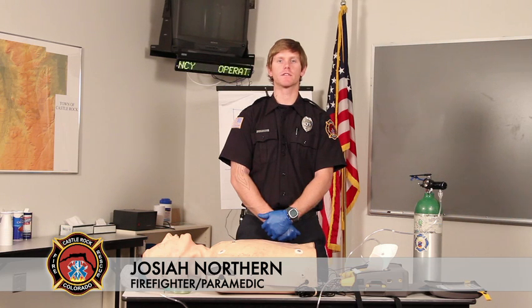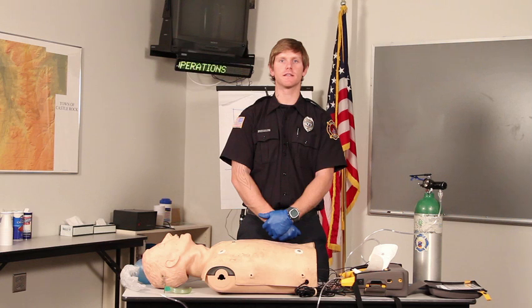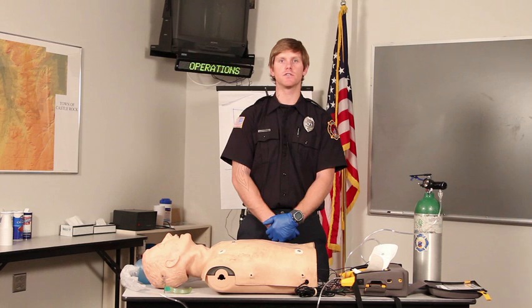Today we're going to be going over the scenario of cardiac arrest management with an AED with bystander CPR already in progress. First and foremost, you want to verbalize body substance isolation precautions. You can also wear gloves and eye protection into this scenario. As you walk into the scene, you want to make sure and ask as many questions as you can and gather as much information as possible from bystanders on the scene.